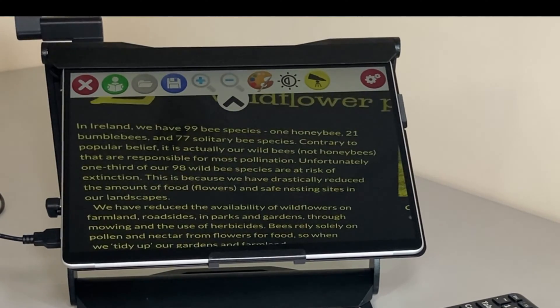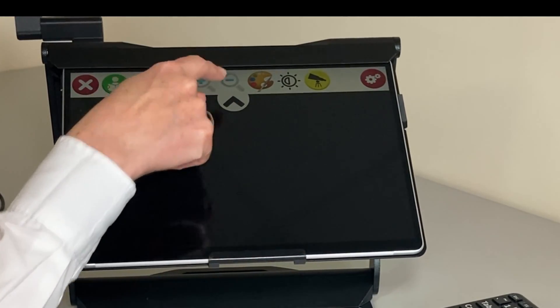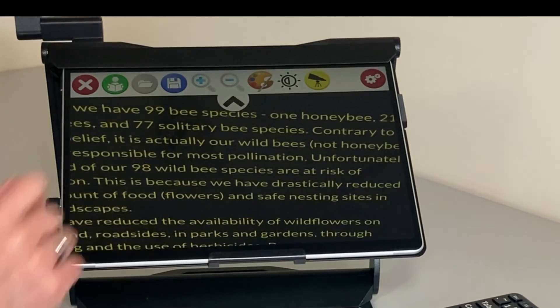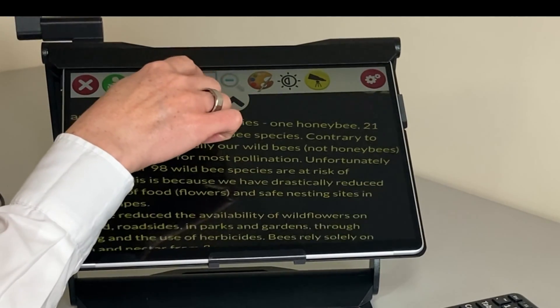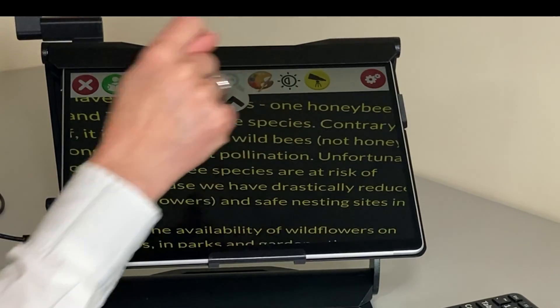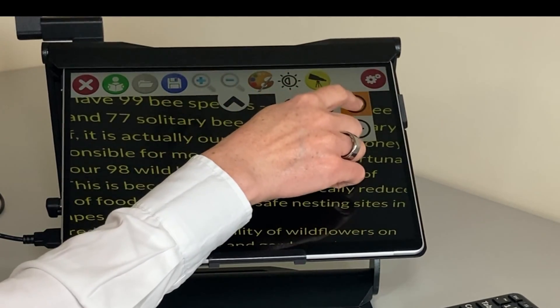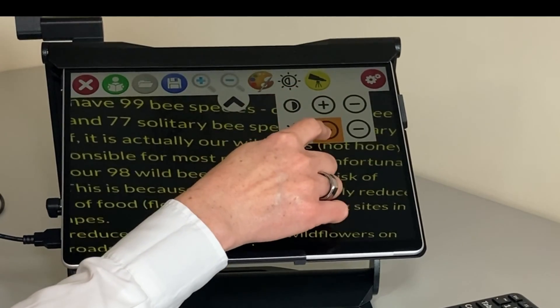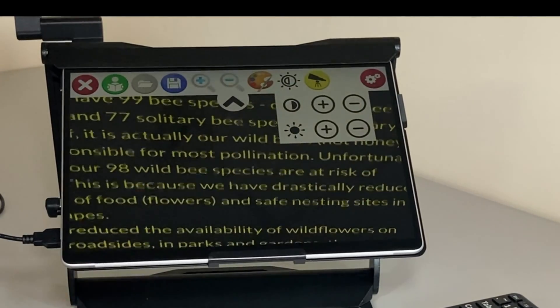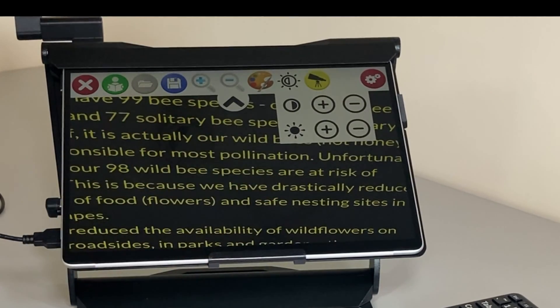Whatever the student is looking at, they can adjust the color scheme to make it easier to read and zoom in and out. We can also zoom in and out with the plus and minus buttons on the toolbar. A new feature on the Mercury 13 is contrast and brightness settings, so whatever the lighting in the room, we can get the best picture.